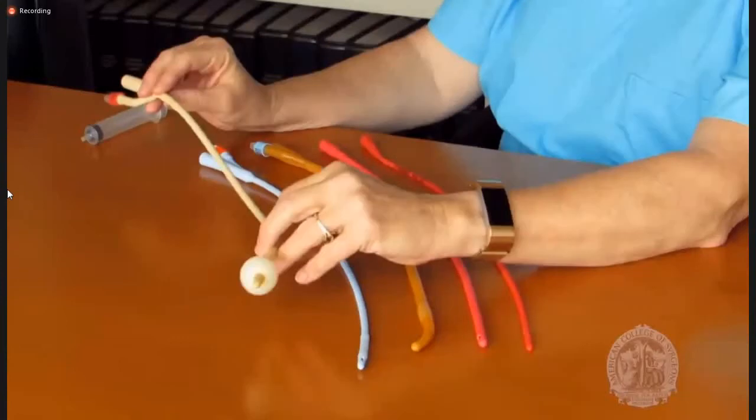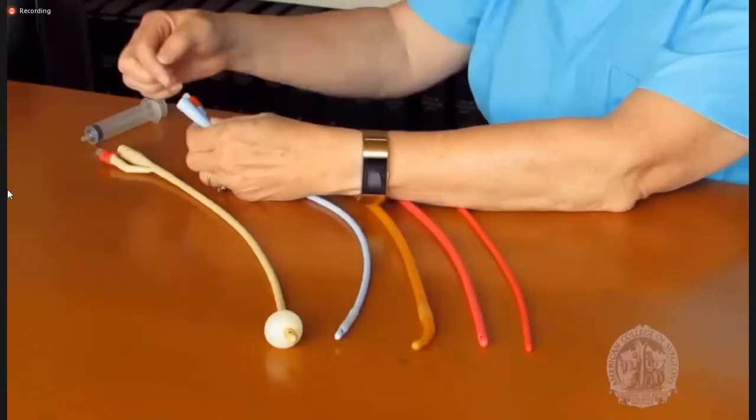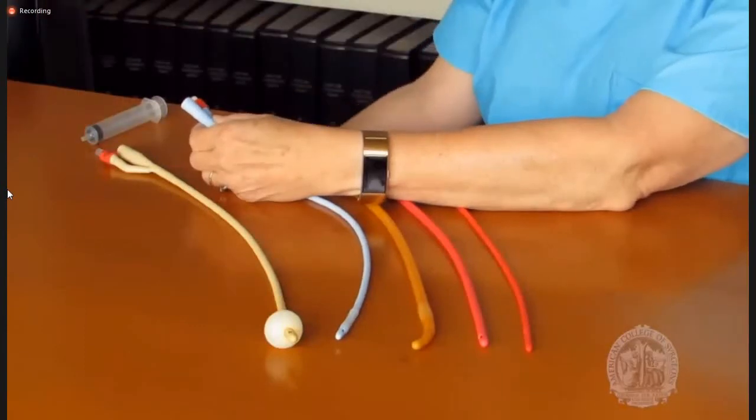I've talked about both indwelling and non-indwelling catheters, so it's probably a good time to talk about that a little more. Indwelling catheters, such as this one, are placed under sterile conditions and have a balloon at the end to ensure that they stay inside the bladder. They're used when the patient will need catheterization for several days. The most common type of indwelling catheter is a Foley catheter like this one. It comes in various sizes, measured using the French system. On the internal end, it has a balloon to ensure that it stays in place. On the external end, it has two branches. One drains the urine into the collection system. It's connected to some tubing and then to usually a bag.